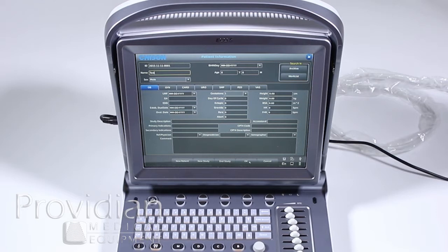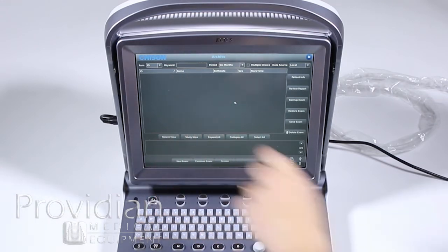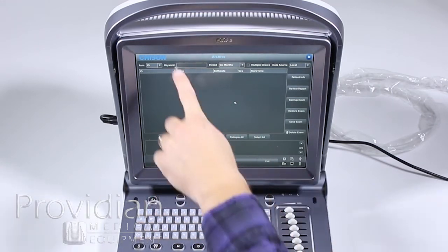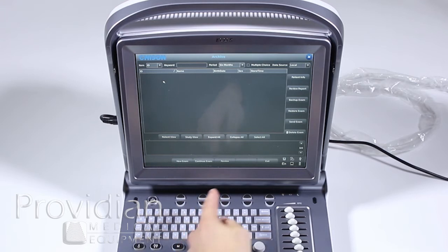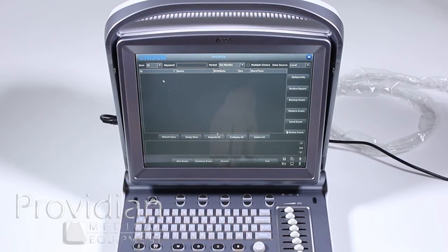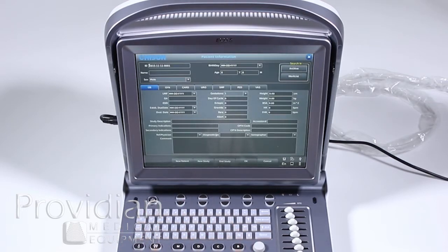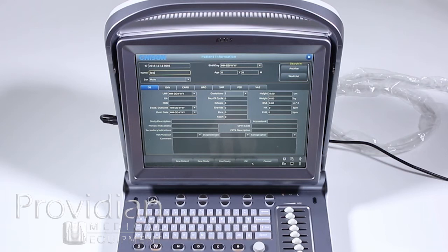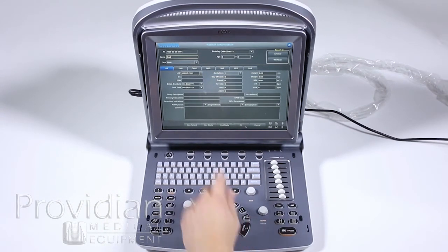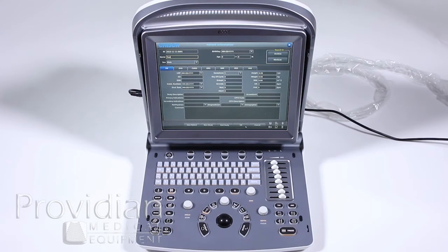There's also a way to select previous exams by going to the archive. This is a new system so it doesn't have any patients on it, but it would let you click on a patient to start a new exam or continue an existing one. Since we're doing a new patient, I'll exit and start a new patient again. All the system really needs is the patient ID, though a name is a good idea. Click OK to proceed.